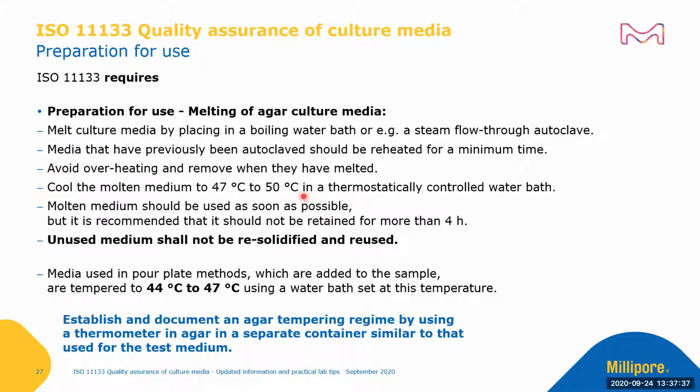Cool the medium to 47 to 50 degrees in a thermostatically controlled water bath. Molten medium should be used as soon as possible, but it is recommended that it should not be retained for more than 4 hours at 47 to 50 degrees. Unused medium shall not be resolidified and reused.